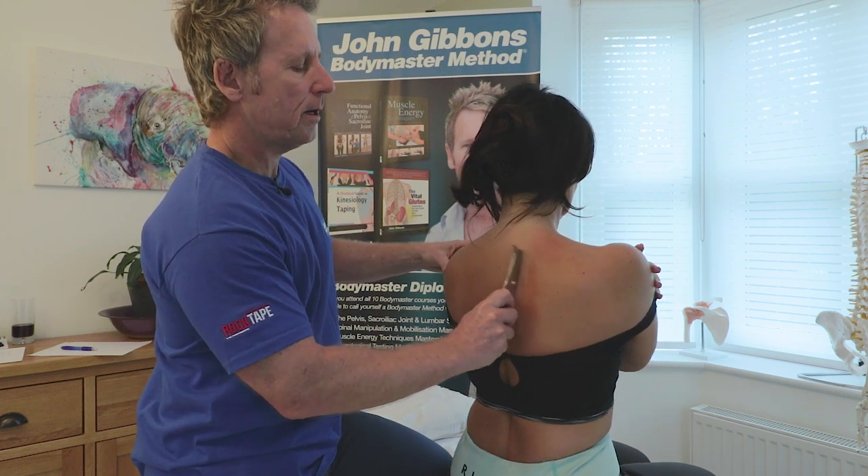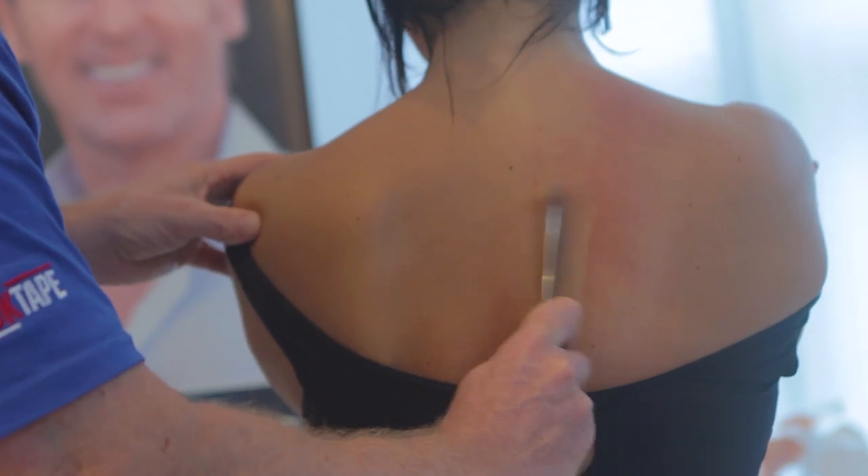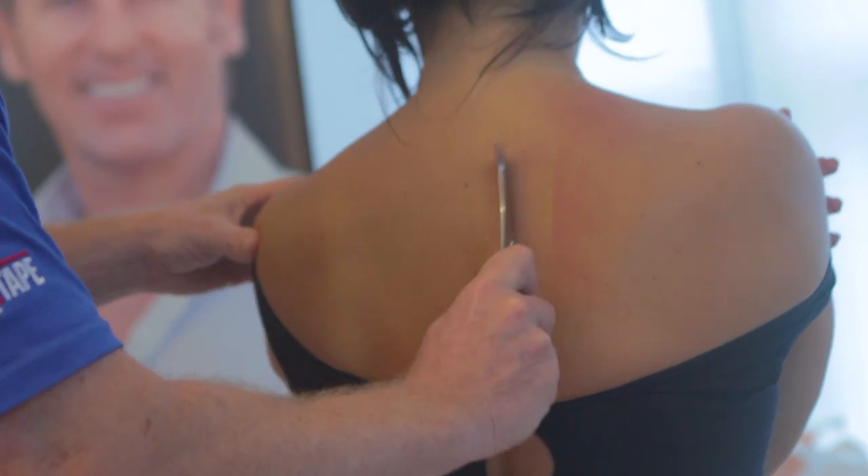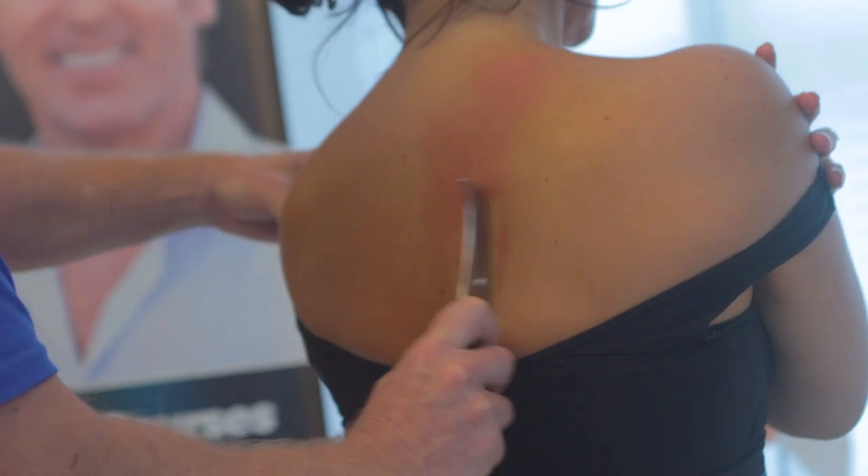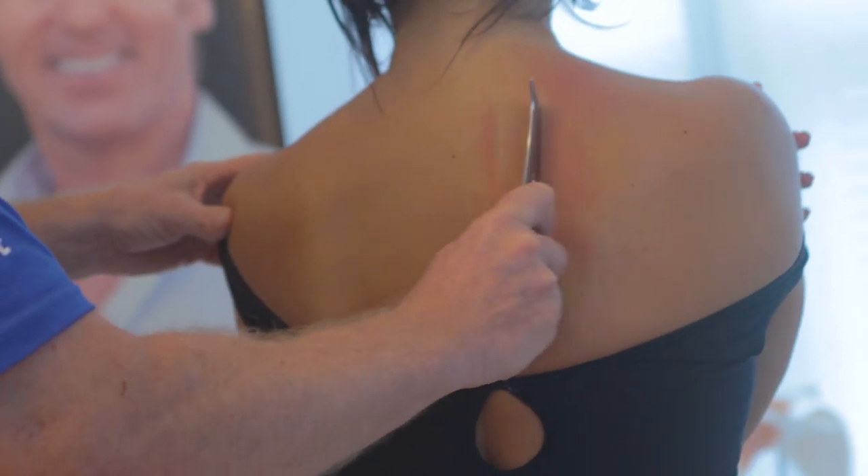Then the patient can slowly rotate one way — maybe start in a slight right rotation, then off they go. We can then ask the patient to rotate to the left and then come back. I can just work through the tissues across this area in here.